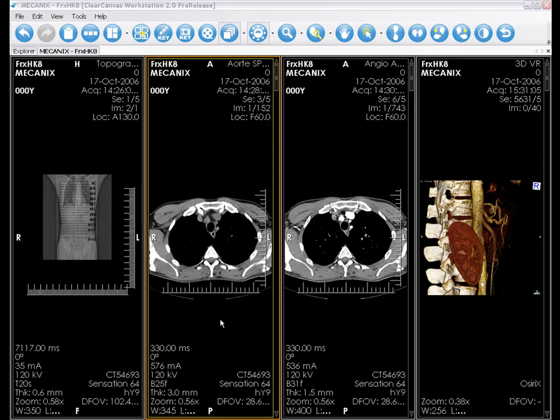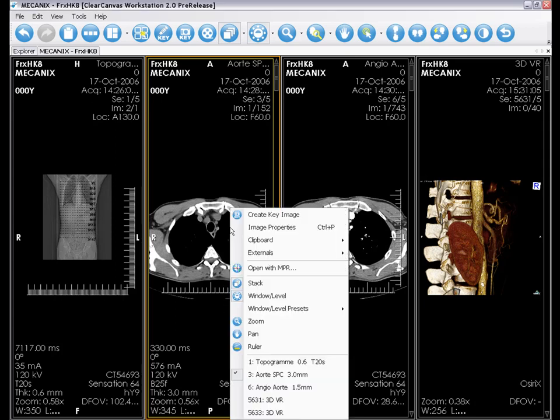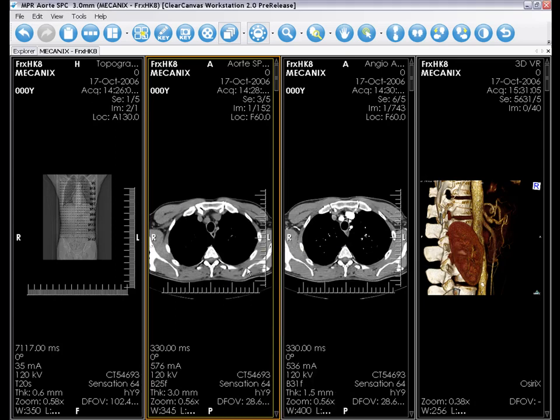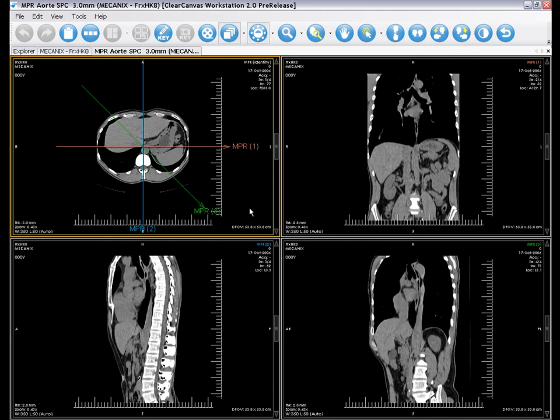You can open the MPR window by selecting a set of images, right-clicking and selecting 'Open with MPR.' In the upper left image box is the original set of images, and in the other image boxes are three other perspectives created from the MPR lines that we see here.